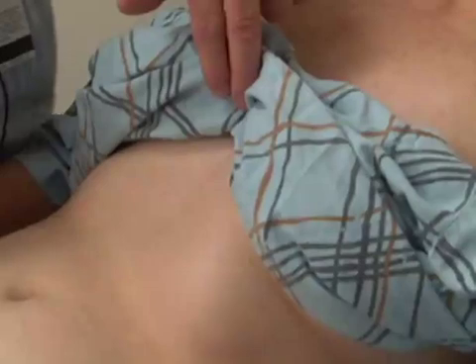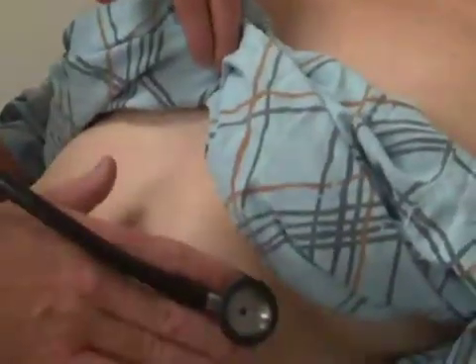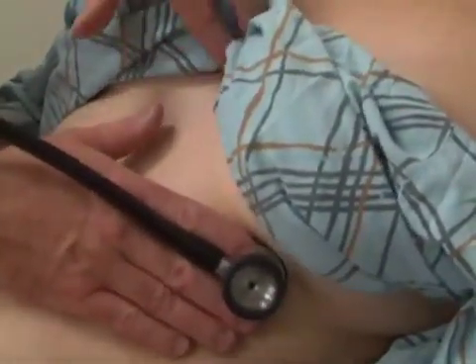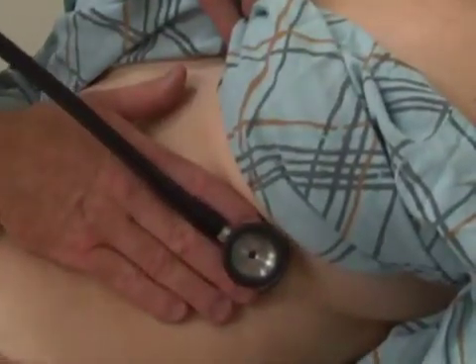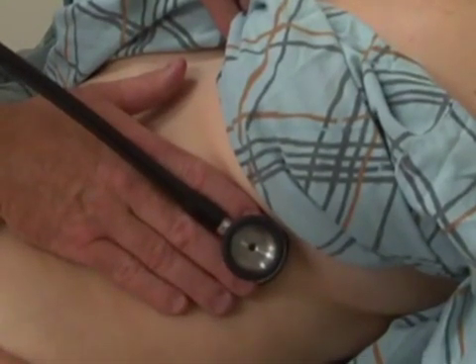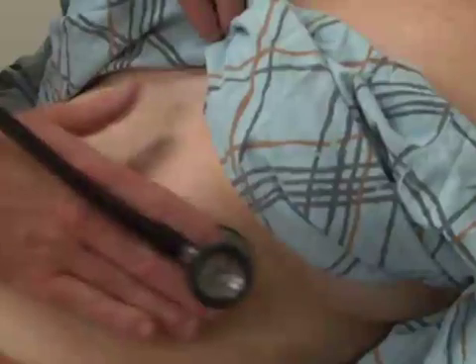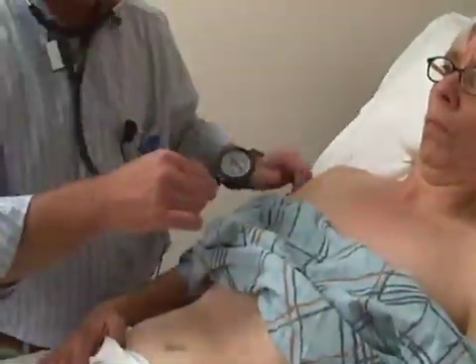And then we're going to move over to the right, the mitral valve, which is located over here at the apex of the heart. And in order to show you the apex of the heart, I've exposed Mary just a little more than we probably need to. But this allows us to hear the lower portion of the heart. And that's about the 5th costal interspace off to the side there. We're listening for S1 and S2 crisp heart sounds, as well as any extra sounds.